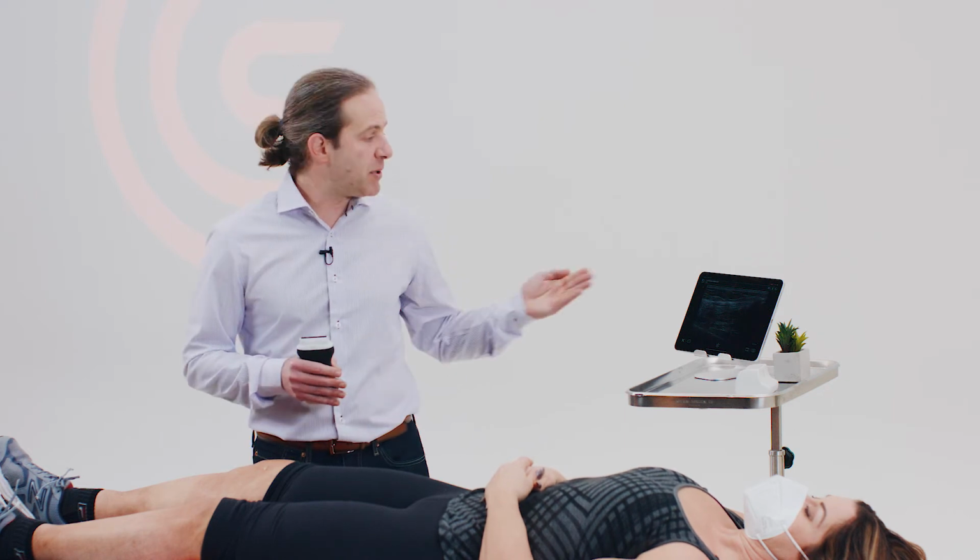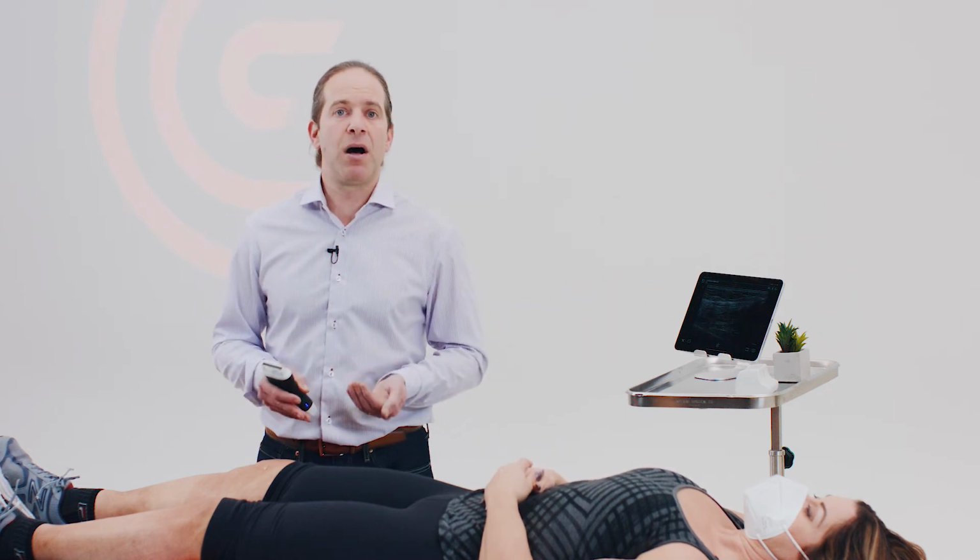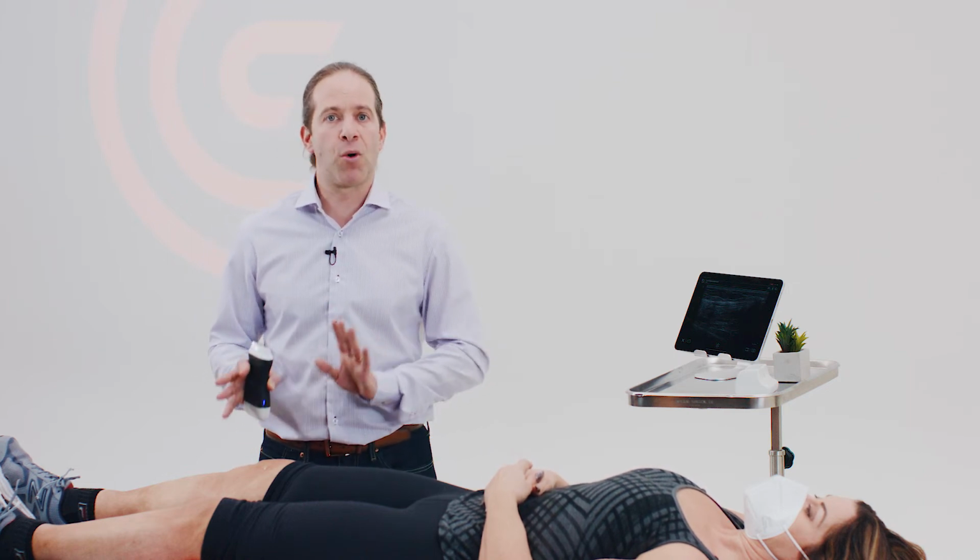Dr. Hirahara makes it look easy. This suprapatellar approach is really only possible with ultrasound guidance, where you can easily visualize a track directly into the joint space without obstruction by any bone or cartilage.